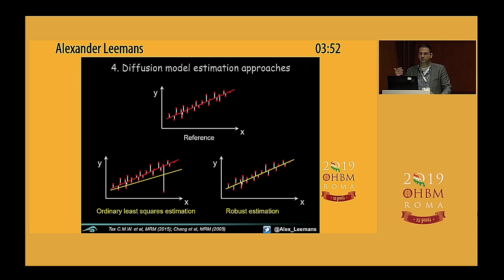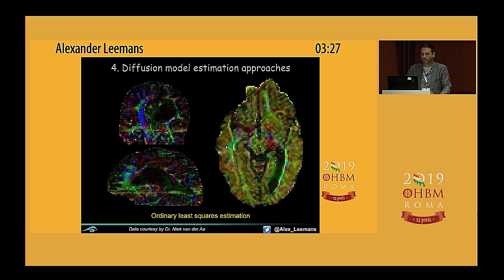And in the olden days, it just took too long to compute, right? It was like tenfold or even longer compared to an ordinary linear least squares. So nobody did it because a doctor will probably wait for 3 minutes because he can get a cup of coffee, comes back, and it's done. But longer, it's not usable, right? So a lot of effort has been put into optimizing speed, and now it's kind of routine to use it.